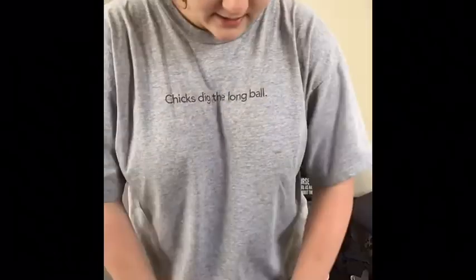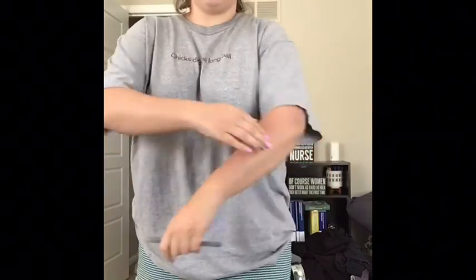So I'm going to stand and do this, and I'm going to use my belly to show you this, because I feel like, I guess I could use the back of my arm, I just feel like it's so hard to do the back of my arm. So I'm just going to use my belly here. Okay, so what I'm going to do is lift up my patient's gown.